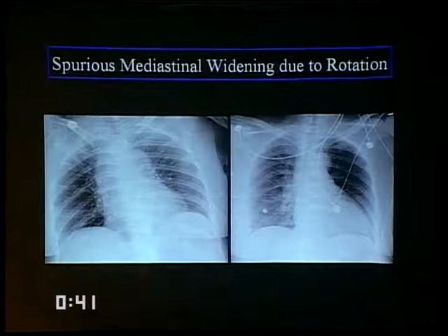In a patient with an actual mediastinal hematoma — this is a post-op CABG — it's a very different appearance, not only in terms of upper mediastinal contours but the amount of opacity. Compare the opacity to the area of the right atrium — this is extremely opaque. There is no visible peritracheal stripe. This is sharply defined and continues upwards. We've totally lost the upper margin of the aortic arch. Some degree of hematoma is routine after cardiac surgery, but this would be considered abnormal and should not be confused with distension of mediastinal vessels. Compare with the pre-op portable on the same patient, where you can define a peritracheal stripe and the upper margin of the aorta.